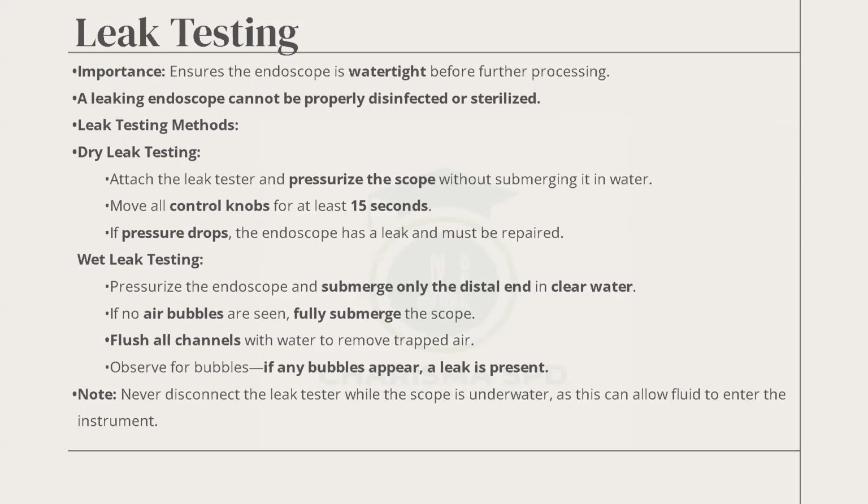Leak testing. You have to leak test it. There's a device. I can explain it for you, but you need to do it to understand what it is. So there's this device that connects to the venting, where we put the venting cap. You connect the device to that part, open up the channel that you want to test to see if it is leaking.